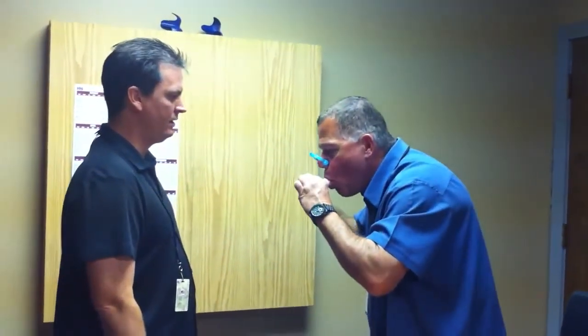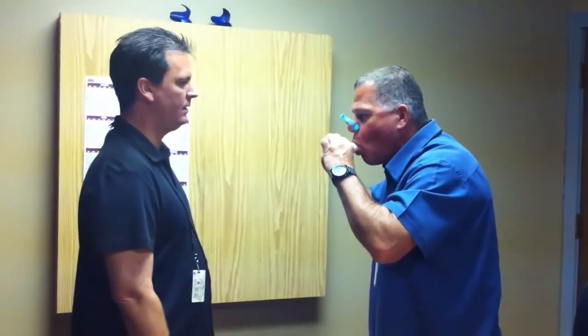Last step. Faster, faster, faster — keep going, keep going, keep going. Get in. Very good.